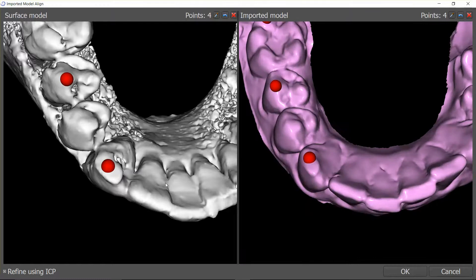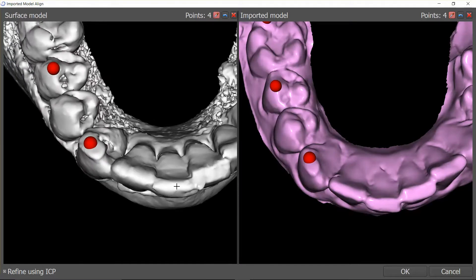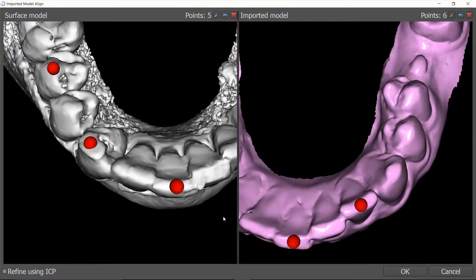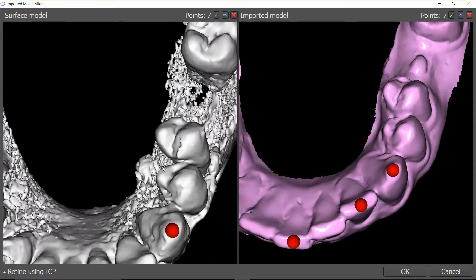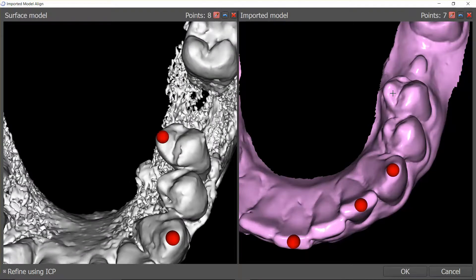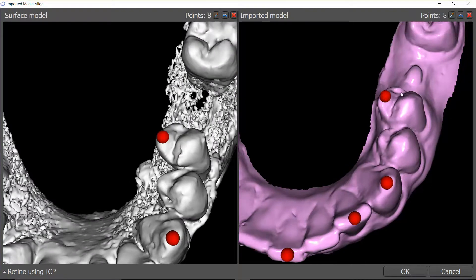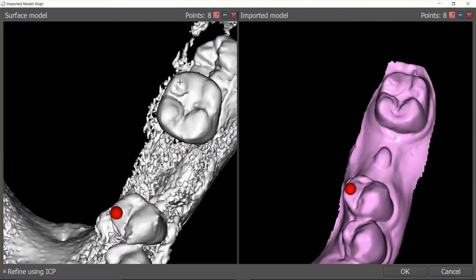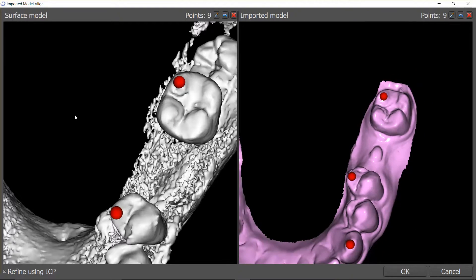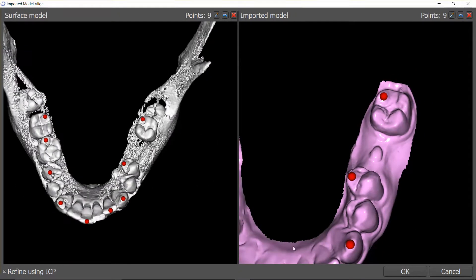I like incisal edges, so I'm going to angle up slightly and place one right in the middle of that incisal edge. Then the cusp tip of the canine, and we'll proceed around the arch this way. You're shooting for seven to ten points — more than that you start getting diminishing returns, and less than that you can end up with a poor stitch. If it's not ideal you may have to go back and redo it, adding or removing errant points. I have nine points, which should be more than enough, and as you can see they're spread throughout the arch, so I'm going to click OK.